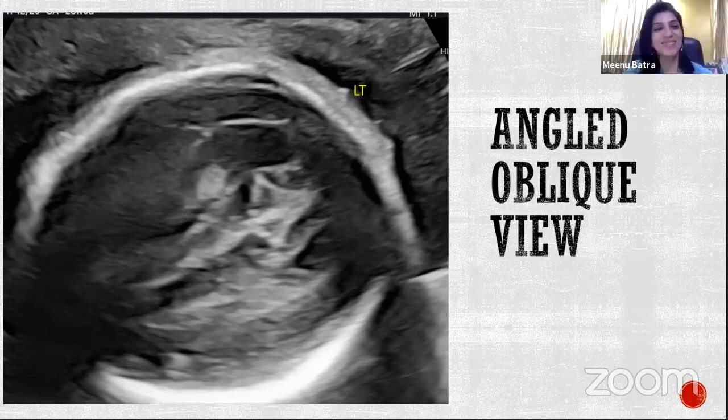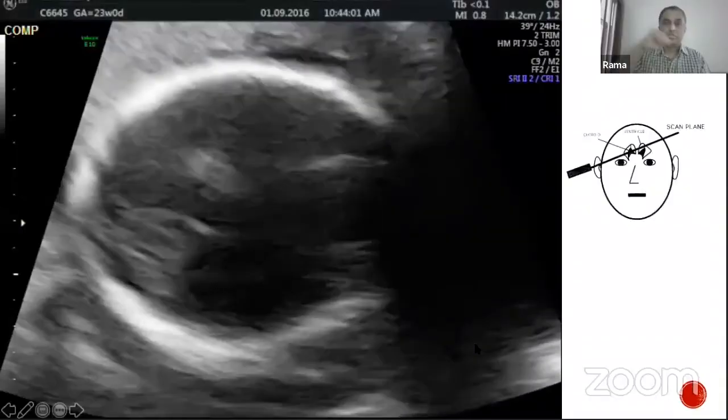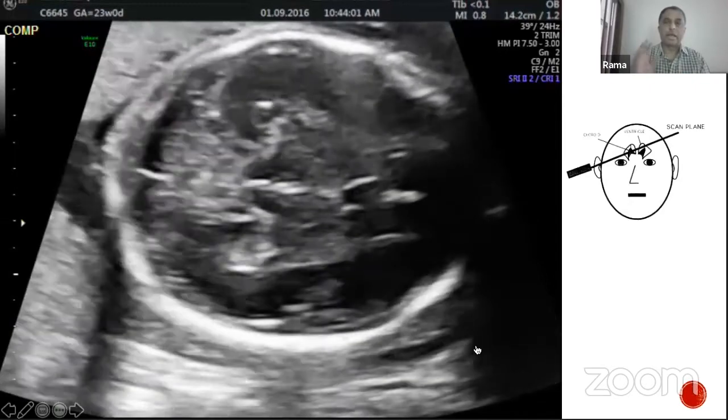Thank you, sir. Now, the near ventricle is a must to be studied. We're not doing the fetus a favor. It should be in our protocol. So once you get your far ventricle and you do your measurement, reflexly, you must go on to the near ventricle. And how do I do that?